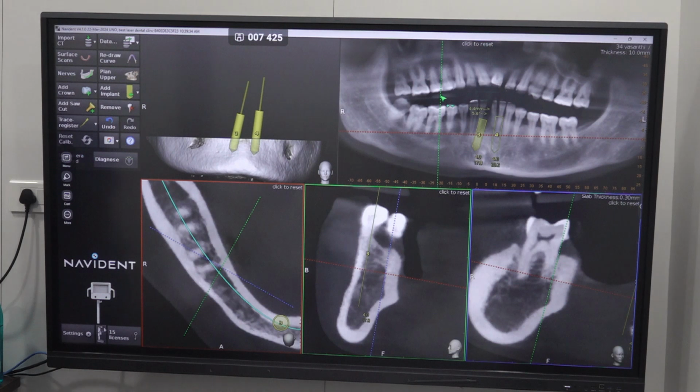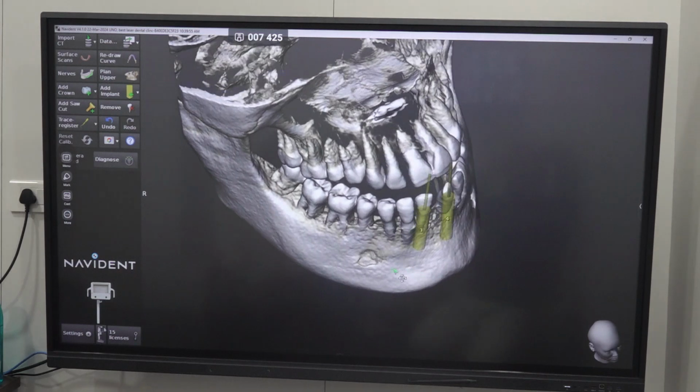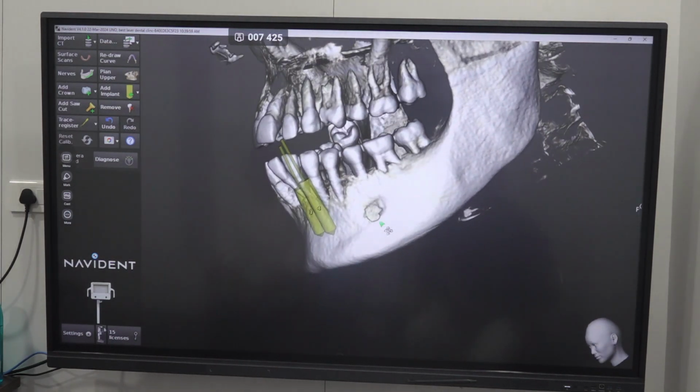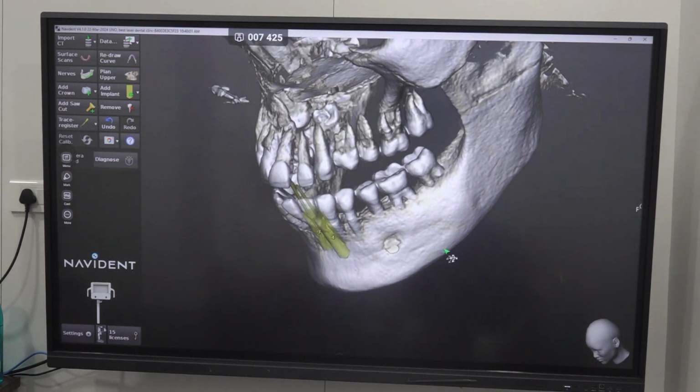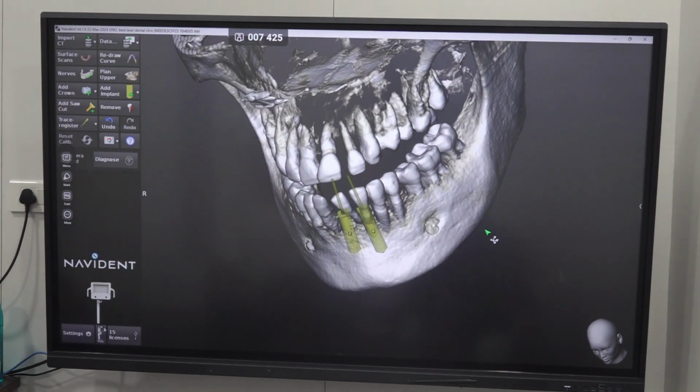You can see the mental foramen is very big here on this patient. So you know the mental foramen is actually very, very wide, right? Once we saw a patient where there is no mental foramen completely on both sides. I was wondering, then I checked the literature. There were 2 case reports till now, completely no mental foramen.